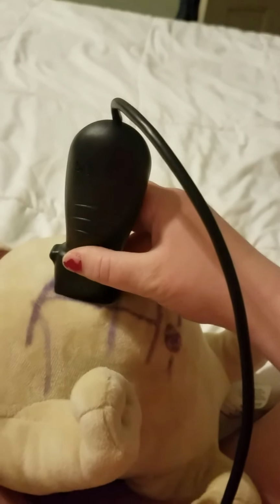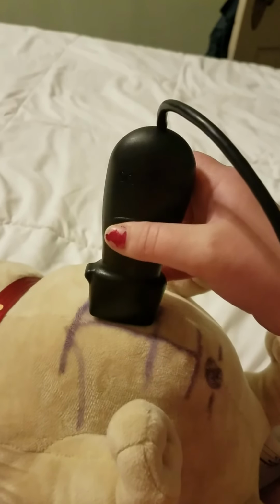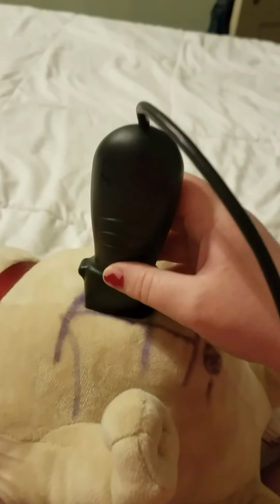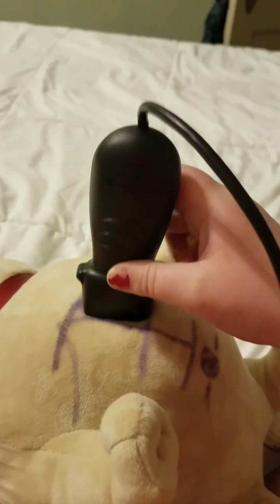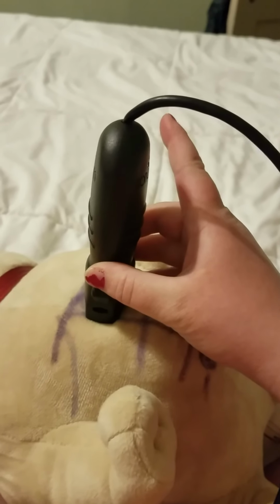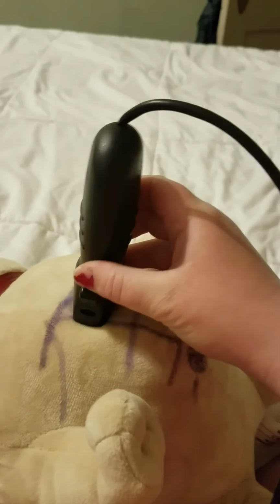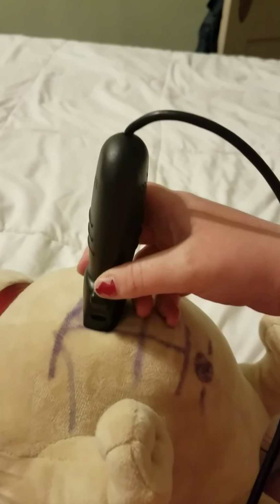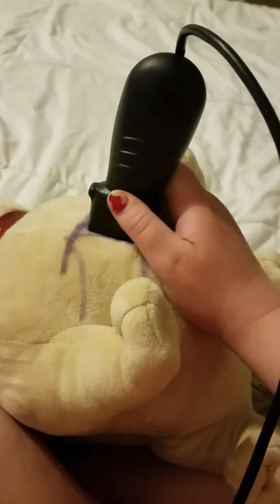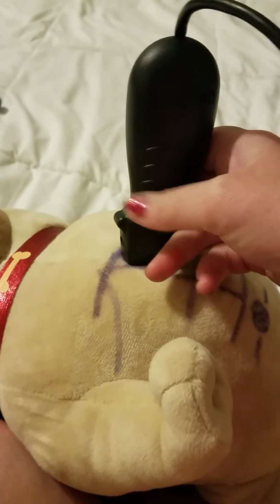Your long image is going to give you the proximal aorta panning across your screen. You're going to take a long image of that, and then a short image of that, and then you're going to take a caliper measurement of anterior to posterior in your short axis, and then you're going to turn back on long, and you're going to do pulse wave Doppler imaging to look at your waveform through this proximal segment. And then you're going to switch back over to short.